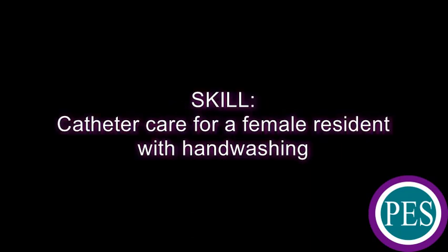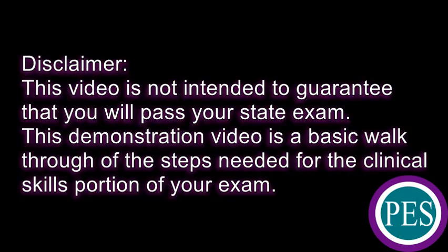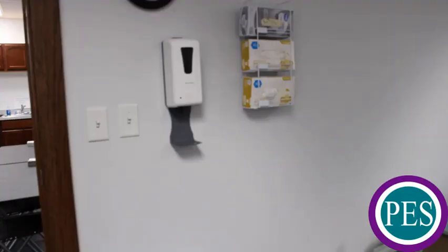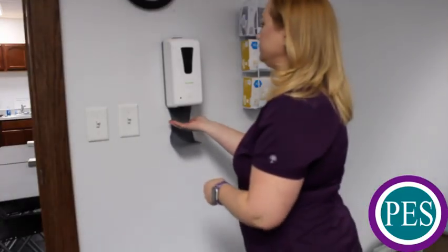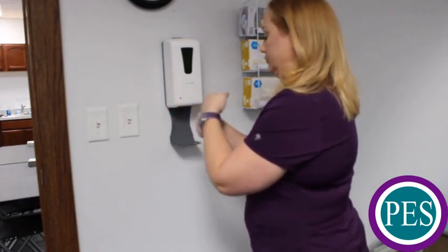Catheter care for a female resident with hand washing. Cover all surfaces of hands with hand sanitizer and rub your hands together until your hands are completely dry.